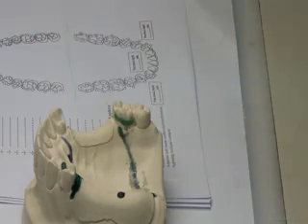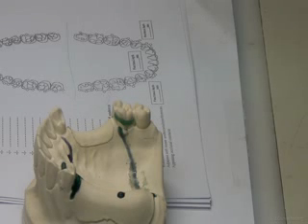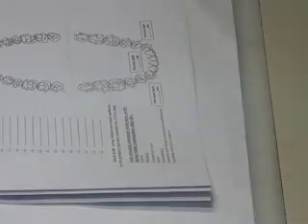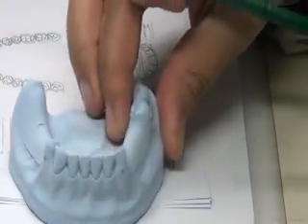What else should I do before I begin my design? Information that will alter my design, and I have to have taken them. I take some information from the survey. What else? What about clinical examination? Occlusal examination. So, because the clinical examination will show me stuff that I could not see on a solid cast. The cast is solid.